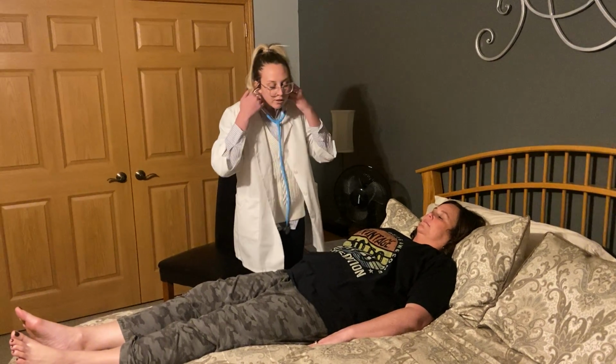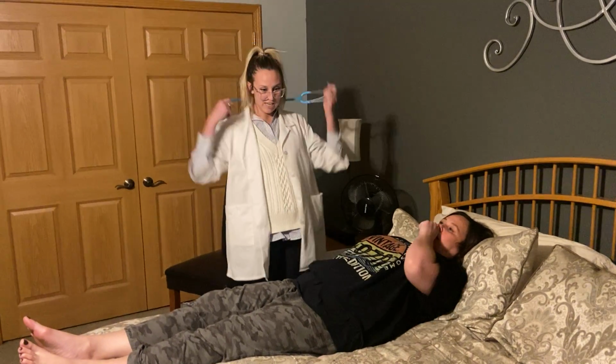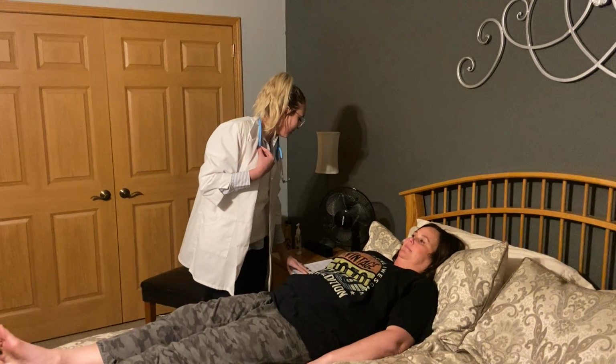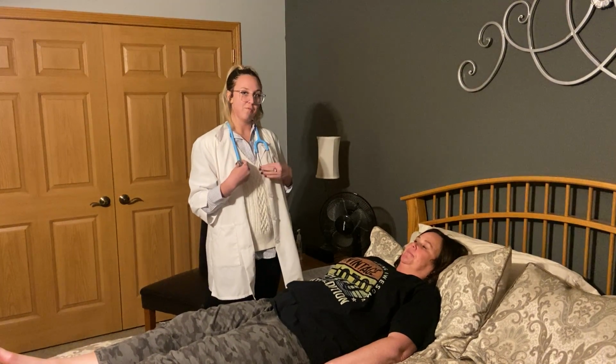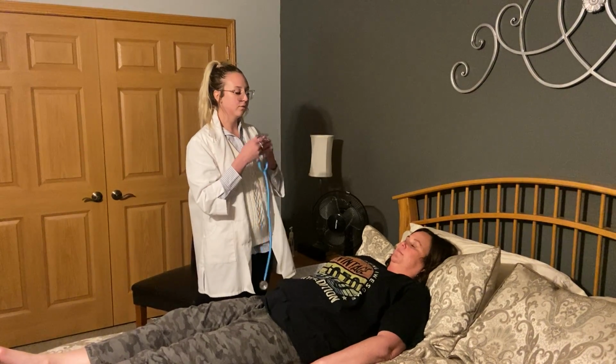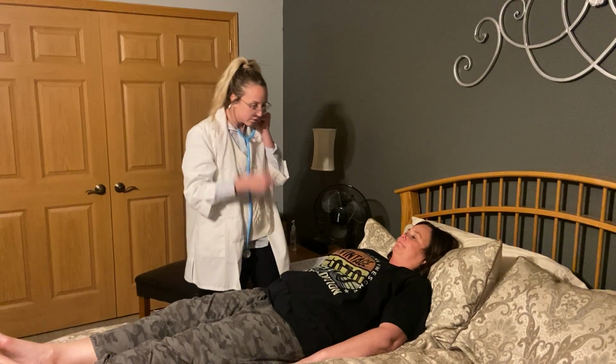Okay, very good. So I don't hear any adventitious heart sounds, any abnormalities with that. Next, I'm also going to listen with the bell of my stethoscope as well. So Rhonda, I'm going to listen with the smaller side of my stethoscope, okay? Mm-hmm.